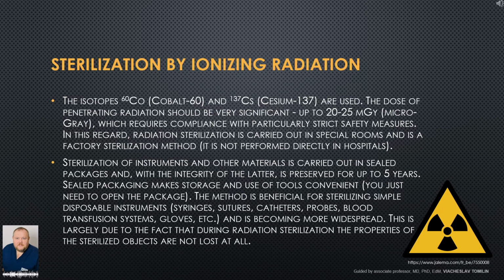Sterilization of instruments and other materials is carried out in sealed packages and, with the integrity of the latter preserved, is maintained for up to 5 years. Sealed packaging makes storage and use of tools convenient; you just need to open the package. The method is beneficial for sterilizing simple disposable instruments, syringes, sutures, catheters, probes, blood transfusion systems, gloves, etc. and is becoming more widespread.